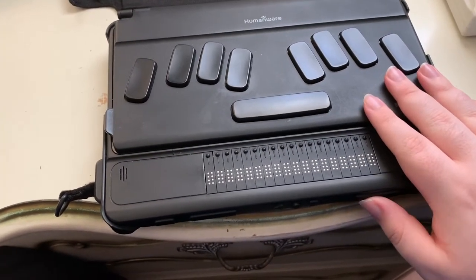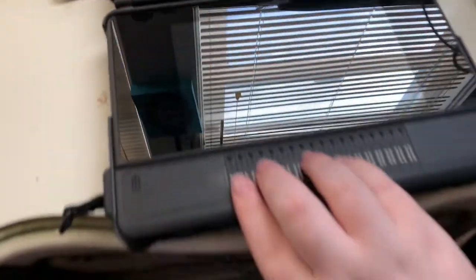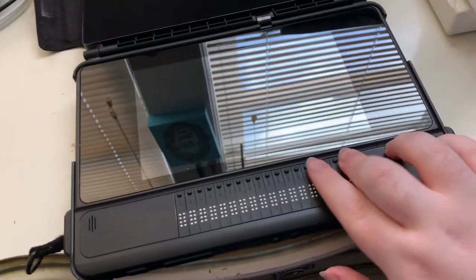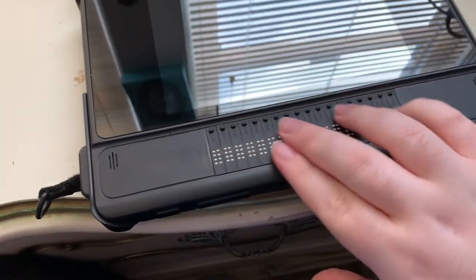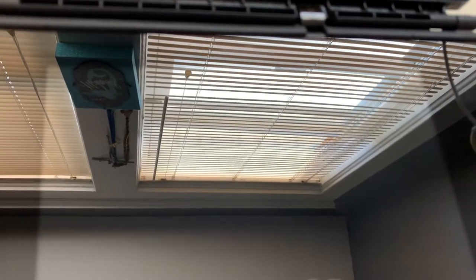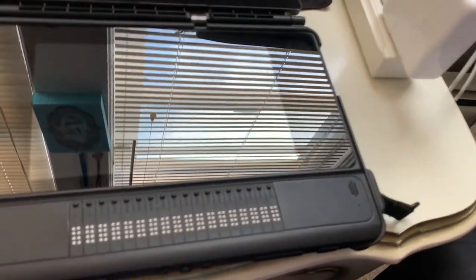Let's boot this up! I'll lift it so we can see — there's a bit of glare even with the shades closed. I'll press and hold power. Let's see if we have any power. Actually, I'm kind of surprised — let me try one more time. Maybe I wasn't holding it long enough. That's a very rare occasion that I don't have power.